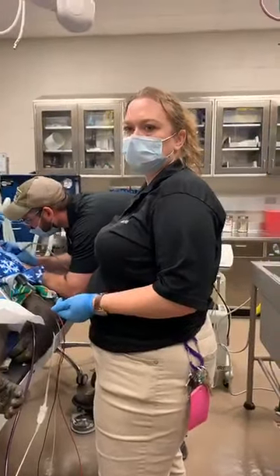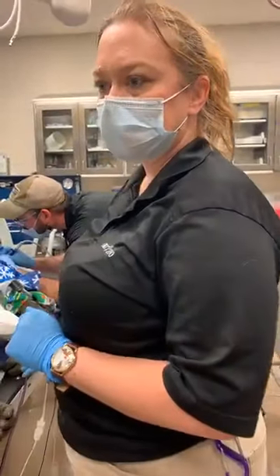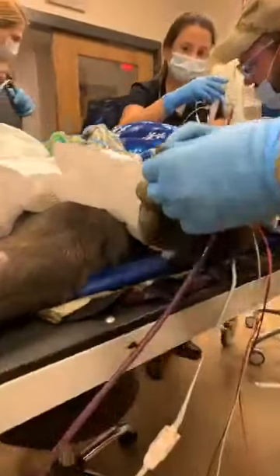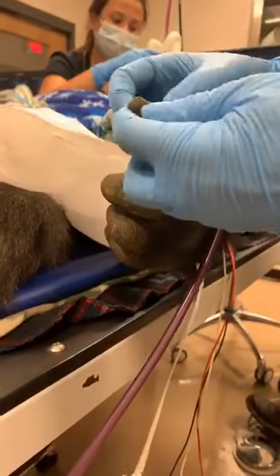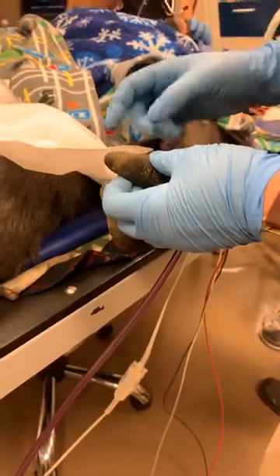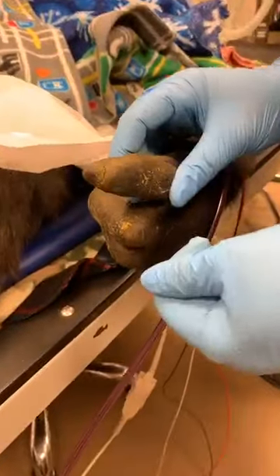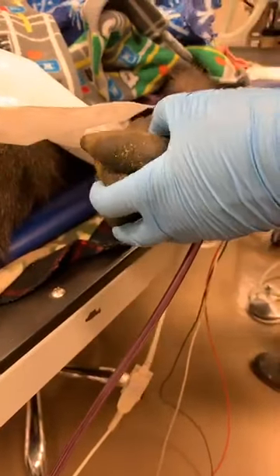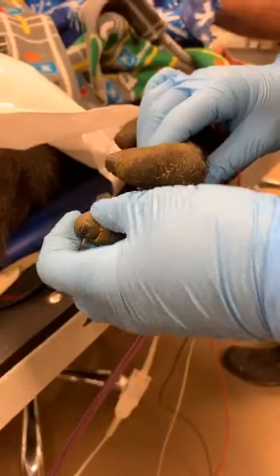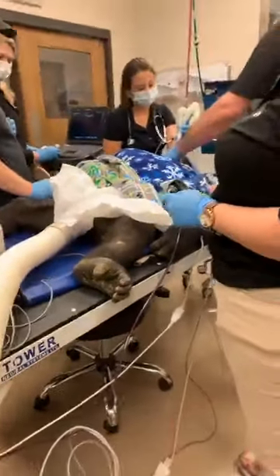Stephanie here is one of our vet techs, so we have a question for you, Stephanie. Karen asked, why do you put the pulse ox on his tongue instead of his finger? You can see their fingers are real short and stubby, so it doesn't necessarily fit the one that we have. The clamp we have doesn't fit on his finger. Also, their skin is very dark, so the pigment in their skin will sometimes affect it as well. If we don't get a reading on the tongue, we'll try a finger, we'll try an ear. We'll try different spots on different animals, but his fingers just weren't working for us very well. Great question, Karen. Thank you, Stephanie.